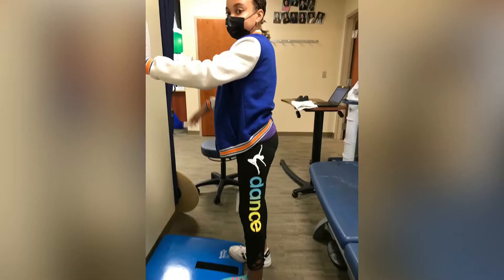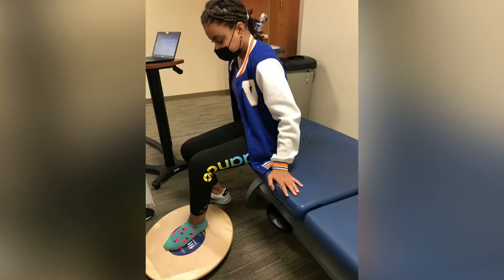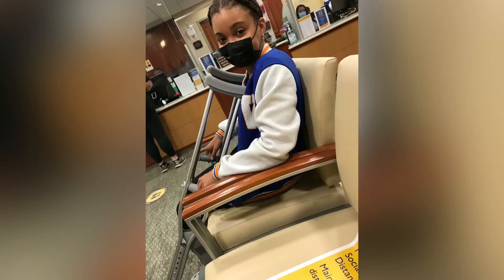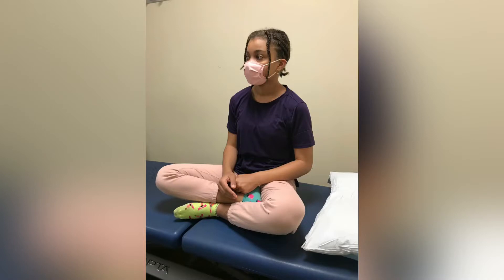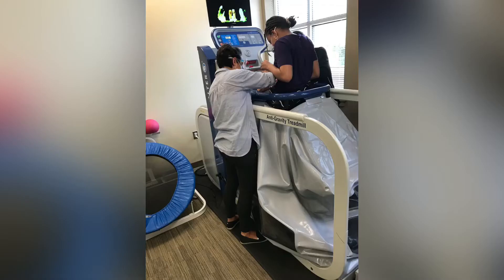Hey everyone, I'm going to be showing you some pictures and clips that me and my mom got while I was at physical therapy for my ankle, so that I can stretch it and be good enough to go to school. I also took a good amount of pictures. Here I'm practicing sitting crisscross, and this is an anti-gravity thing — it basically lifts your weight off when you walk.